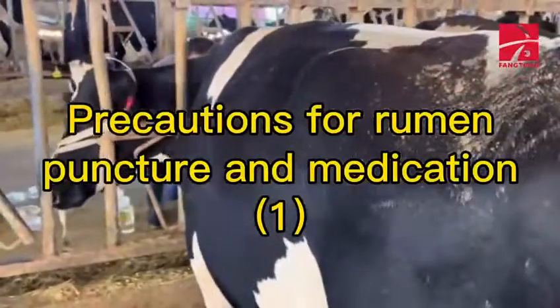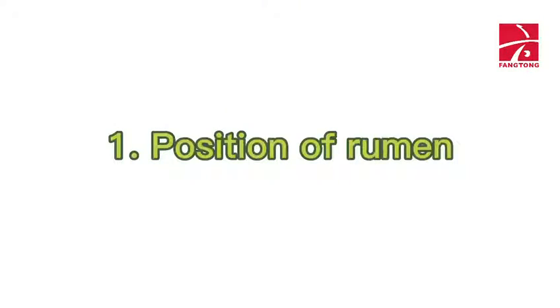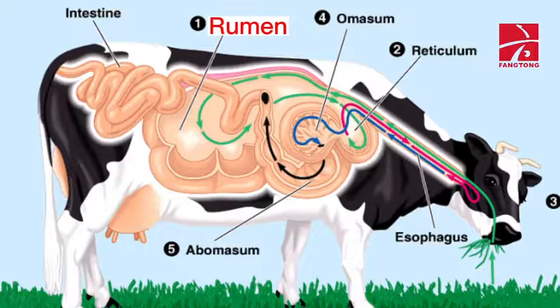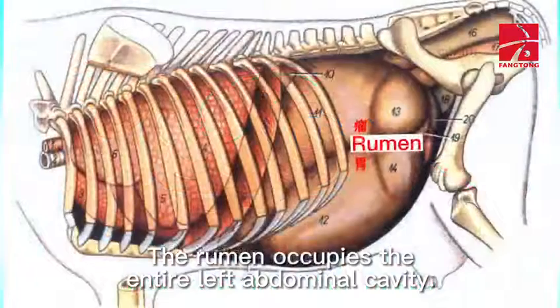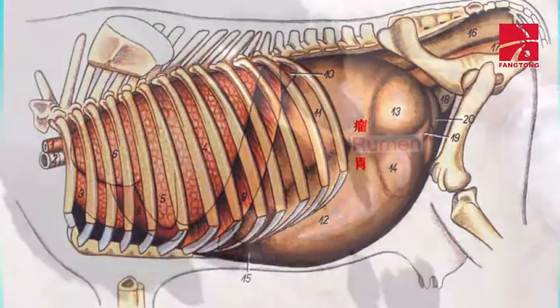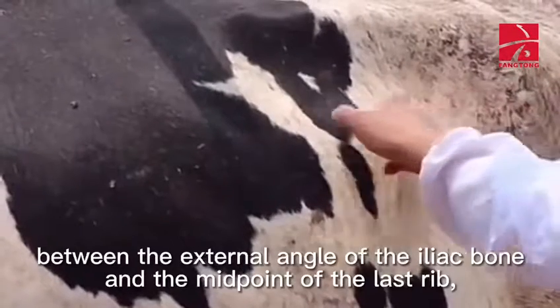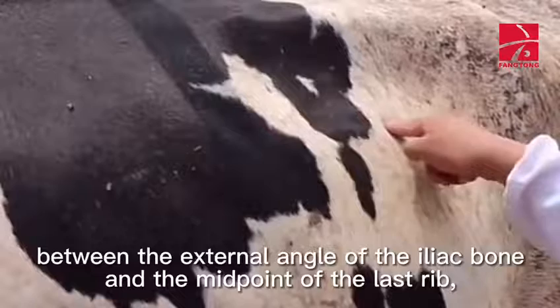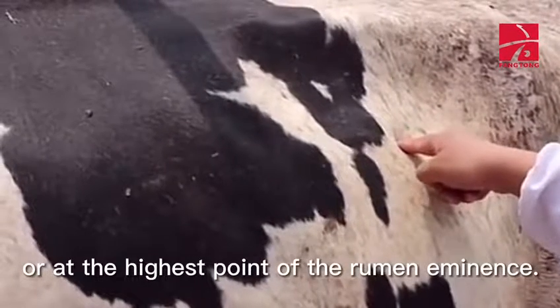Precautions for rumen puncture and medication. First, the position of the rumen: the rumen occupies the entire left abdominal cavity. The puncture point is at the center of the line between the external angle of the iliac bone and the midpoint of the last rib, or at the highest point of the rumen eminence.